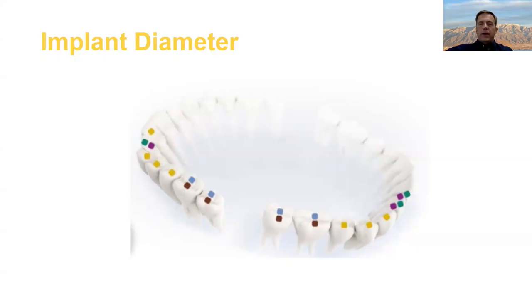Let's start by talking about very narrow implants. Almost every implant manufacturer, at least the ones I'm familiar with, has an implant that's between 2.9 and 3.1 millimeters in diameter. These are really handy in the mandibular incisor area and can also be helpful in the maxilla, depending on the person's anatomy.